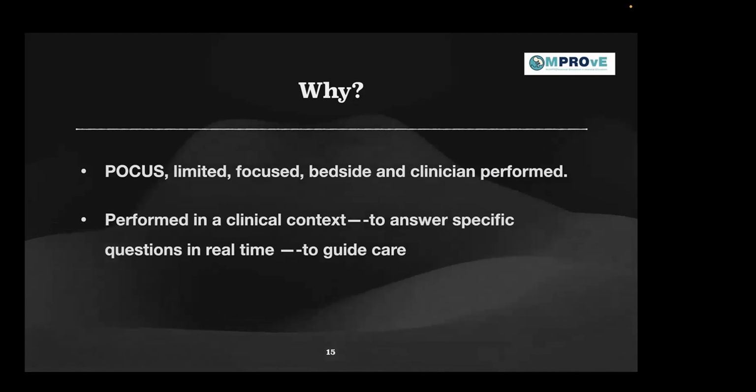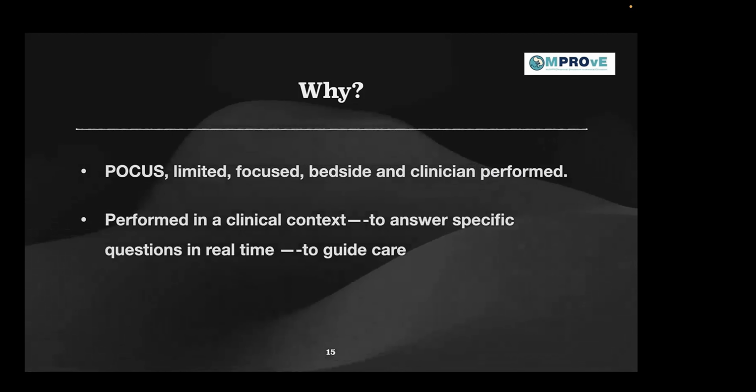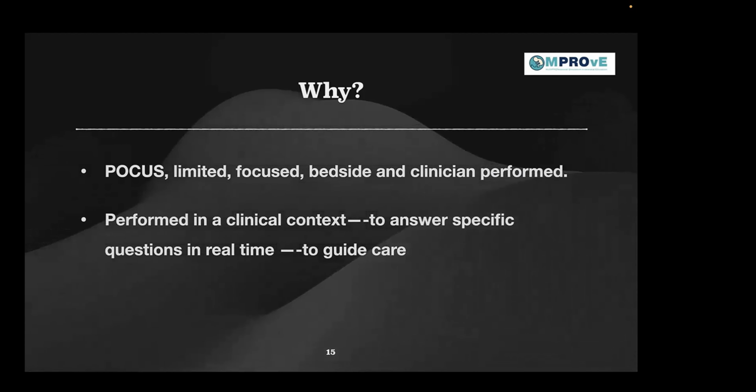So it is always done in a clinical context, and I cannot emphasize it more. I think Alok has spoken many times about it. So it's all about the clinical context, the clinical background, because lung ultrasound, you don't see lung, you only see the artifacts. And those artifacts can be generated in a wide variety of pathologies, in a wide variety of clinical conditions. So to correctly interpret those things in terms of the clinical scenario, you need to have a background of the patient or of the baby. So it's very important it is done in a clinical context.